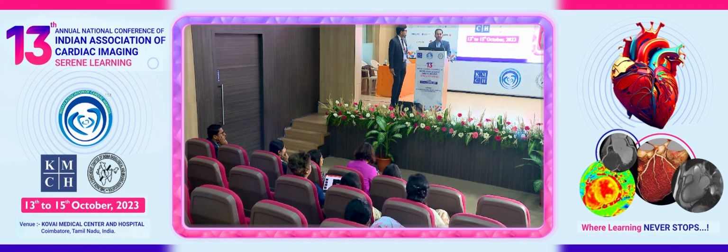Dr. Johnson in his talk mentioned that plaque volume is the new trend in our field. So I think in the next couple of years you will see more and more people focusing on plaque volume quantification and slowly moving away from CT-FFR.